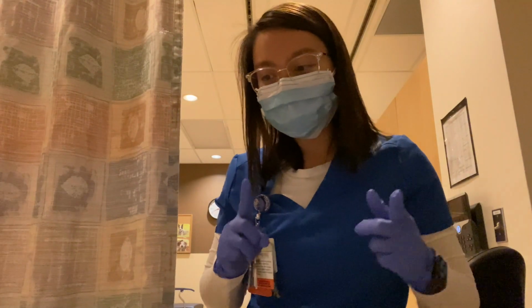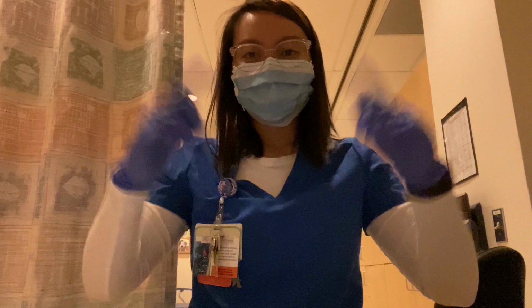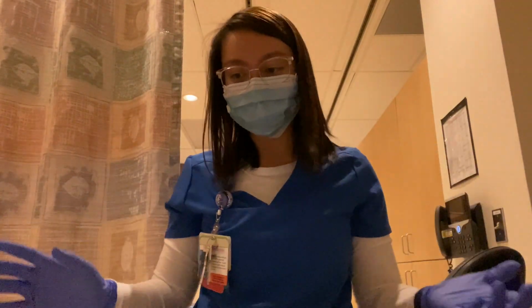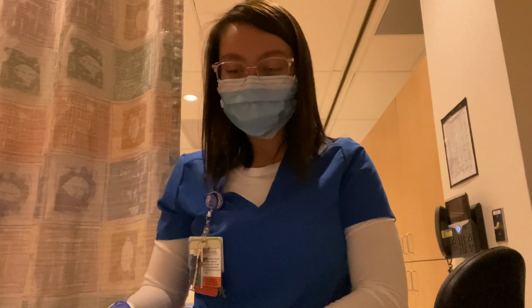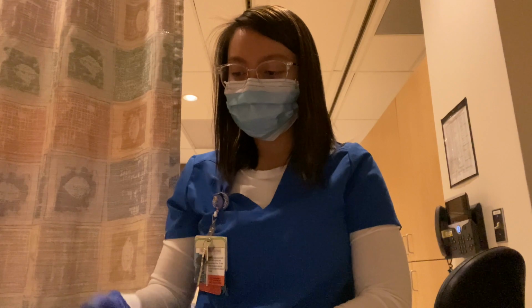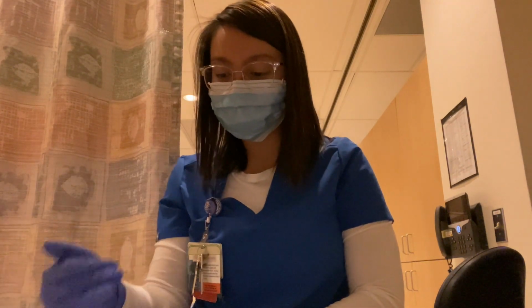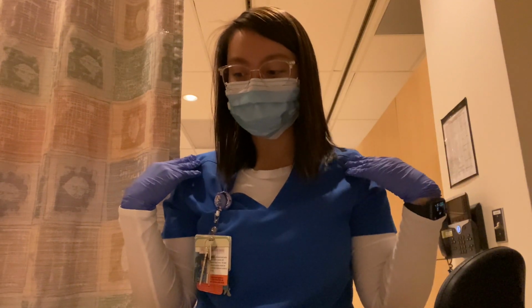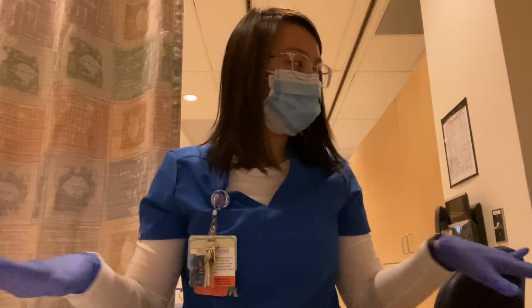And in order to do procedures, we have all their paperwork here. We have a consent form that the patient is going to sign after the radiologist explains what's going to happen. We have the lab work. We need to make sure that the platelets are good, that the INR is good. We make sure that the ordering doctor is on here, the procedure, and if they choose a side, right or left side, we go by that. And we have all that here.